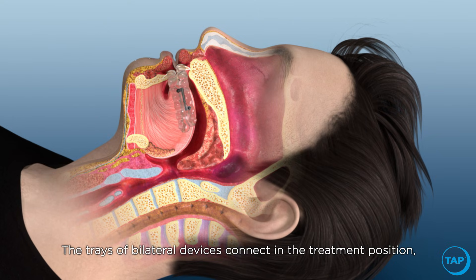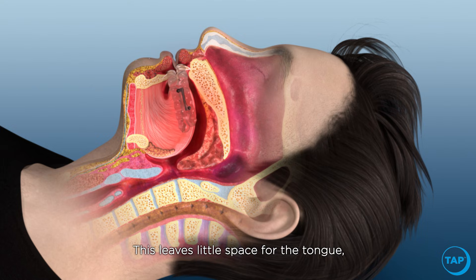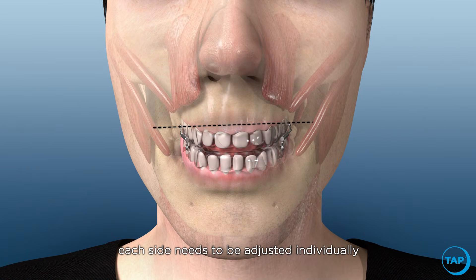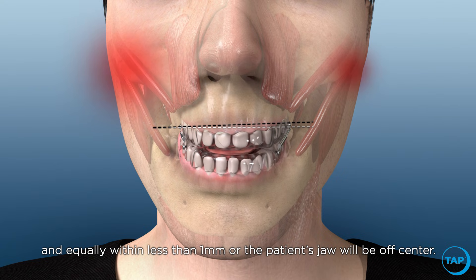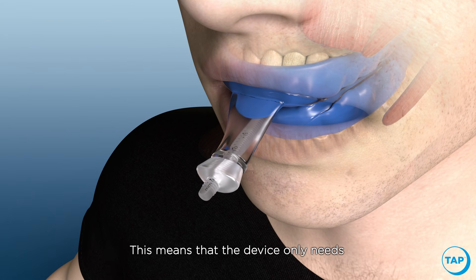The trays of bilateral devices connect in the treatment position with hardware filling the space between the teeth. This leaves little space for the tongue, making bilateral devices less effective. Additionally, each side needs to be adjusted individually and equally within less than one millimeter, or the patient's jaw will be off-center.